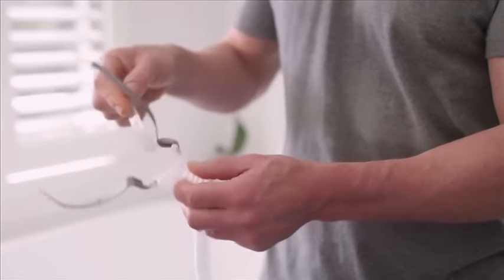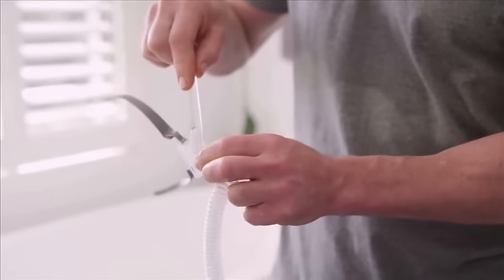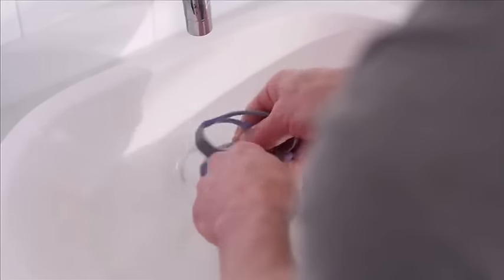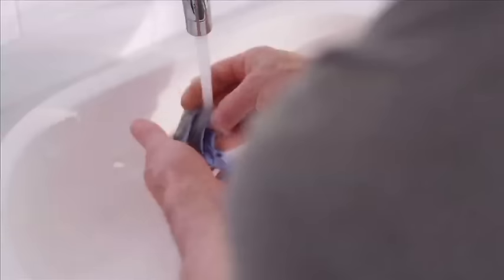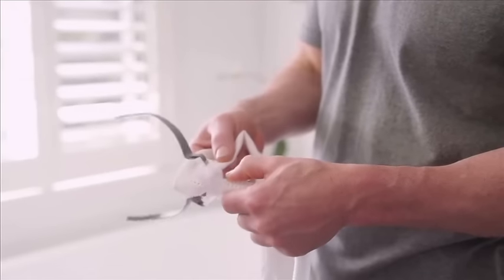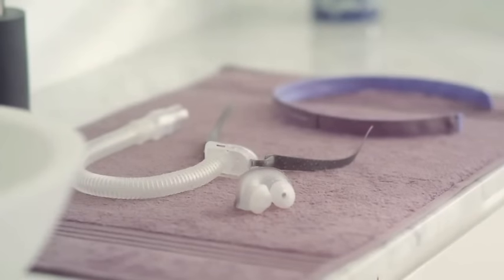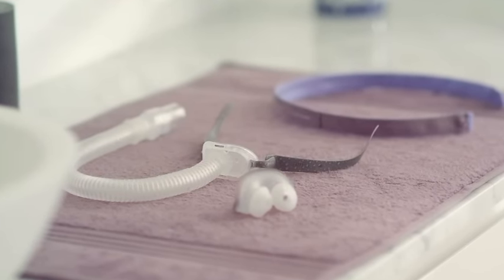Over time, the vent may discolor, but don't worry — it's not a safety concern and won't affect the performance of your mask. Hand wash the QuickFit headgear once a week in warm water using mild soap, and you don't have to remove it from the mask to do it. After cleaning, rinse all components in tap water. Dry the vent by gently wiping it with a cloth, and make sure it's dry before the next use. Allow all other components to air dry completely, avoiding direct sunlight.